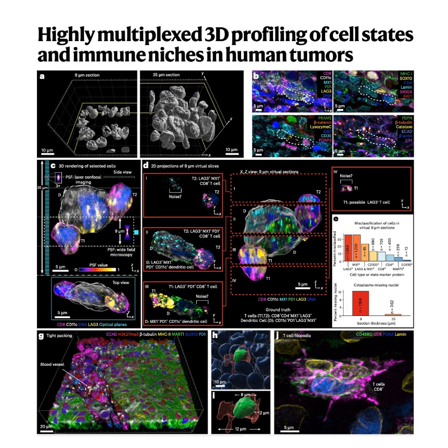Exactly. And more than that, this new capability to study molecular events like PD1, PDL1 clustering, right down to the level of specific membrane contact types, the type 1, 2, and 3 interactions, it fundamentally changes how we need to model and understand the tumor microenvironment. Proximity isn't enough. The type of contact matters. We really need to think in terms of nanometers and interaction types, not just microns and neighborhoods. That's the shift in thinking required, yes. If we truly want to understand why an immune cell is active or suppressed, or why a therapy works or fails, we need to know if it's forming a tight 70 nanometer type 1 synapse, or if it's just sitting 500 nanometers away in a type 3 cluster, receiving different signals. They imply vastly different biology.